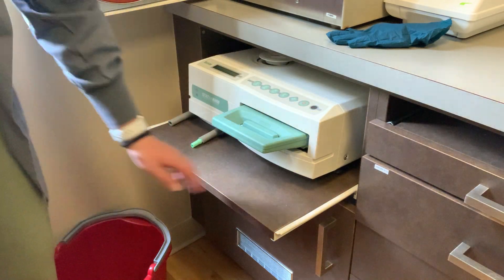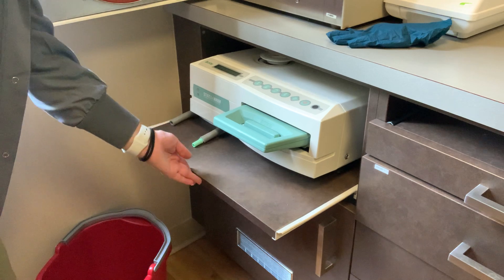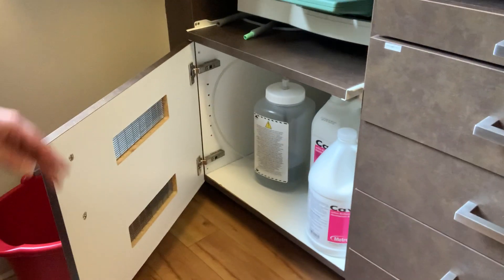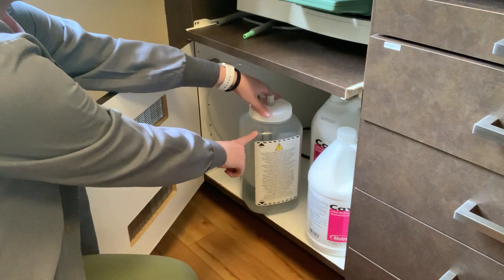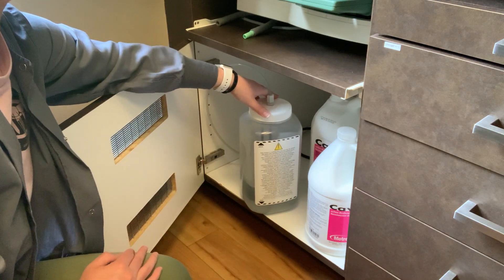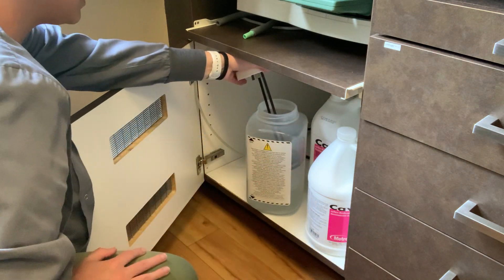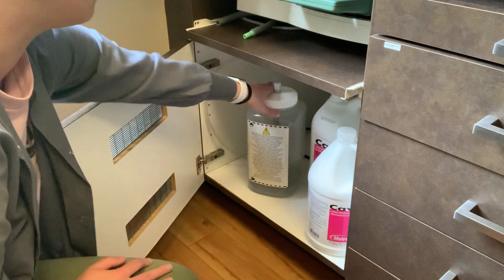There's also a level bubble here that shows if the machine is level. If it's not, there are little legs underneath that you can twist to balance it out. The water drains down from there into this bucket below. The bucket has a maximum and minimum fill level, so the water needs to be within that range. Always check that before running it as well, because you don't want it to overflow, and it might not work properly if it's too full.